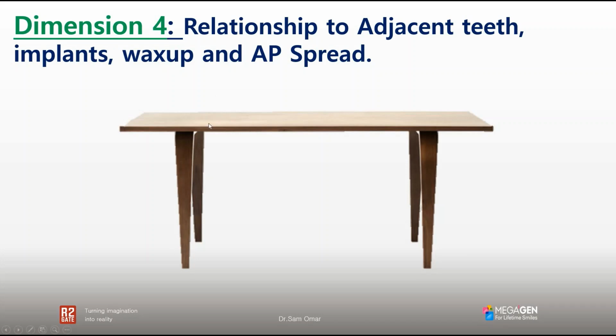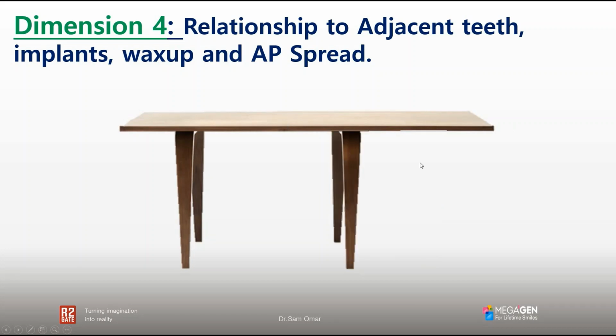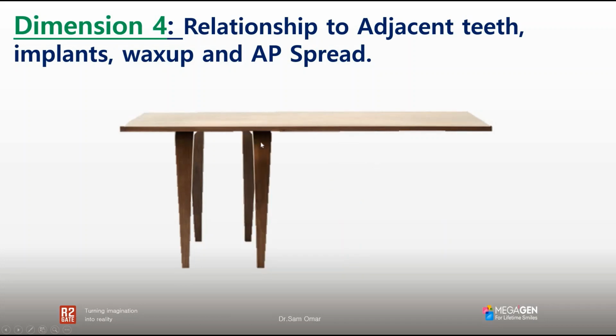So how does that really affect us when we're doing the prosthesis? Well, think of the prosthesis as a four-legged table, as we can see right here. In this particular case, we have legs at the front of the table and legs at the back of the table, and this will be a very stable table. On the other hand, in some cases we have to move our implants a little bit to the front, and then we'll end up with a slightly less stable prosthesis. And in other cases, if we have a long cantilevered section, it's a lot less stable.